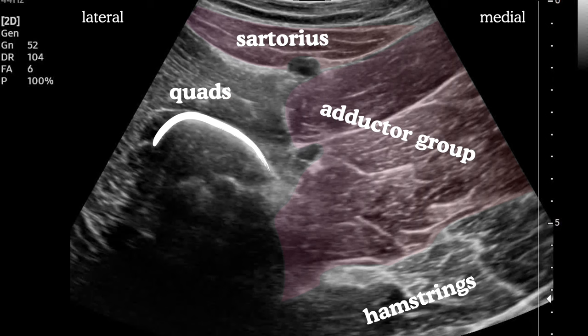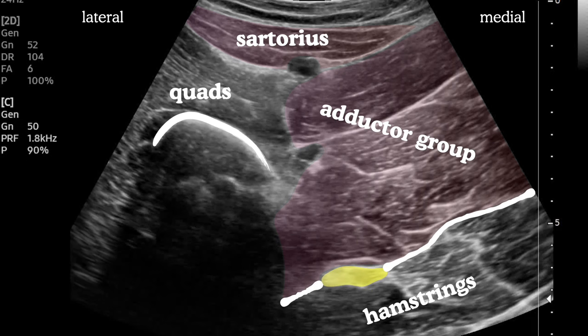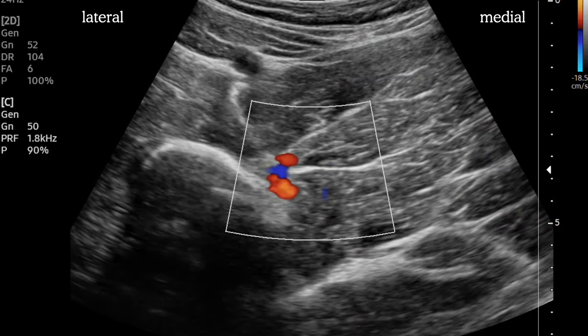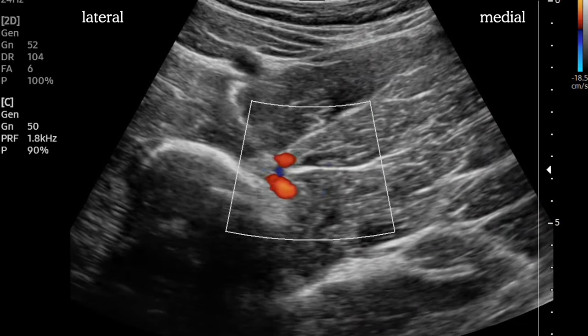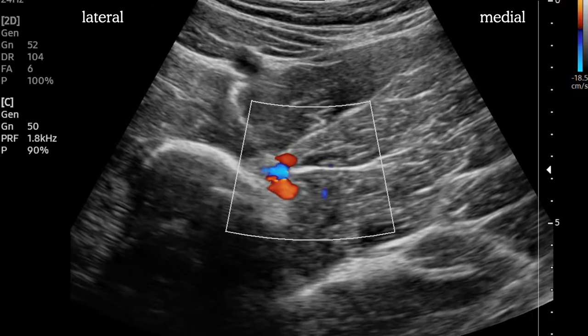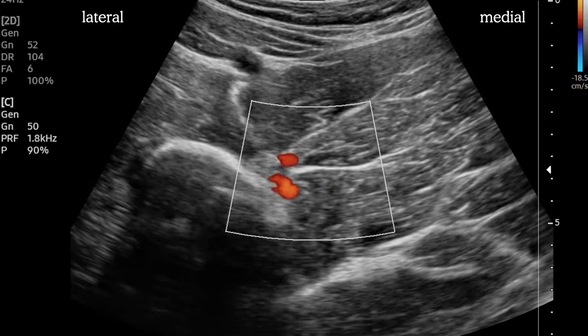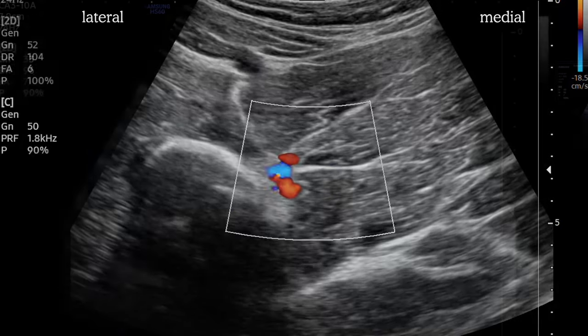The hamstrings are the deepest muscle group seen here, and the sciatic nerve is quite obvious in the fascial plane between. Don't forget about the profunda branches which lie adjacent to the femur — it's worthwhile putting on color Doppler to make sure your trajectory is safe.